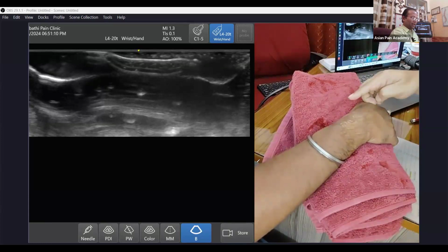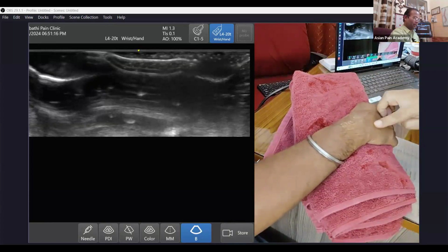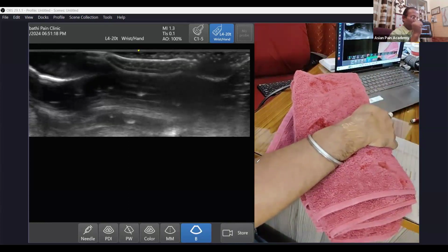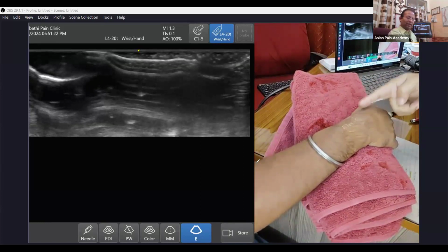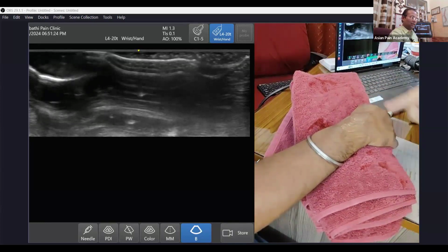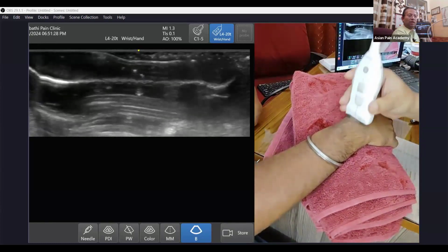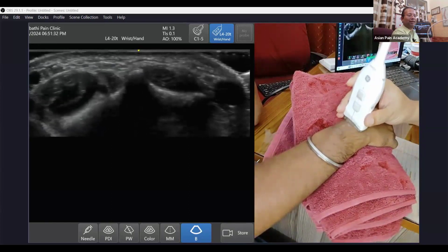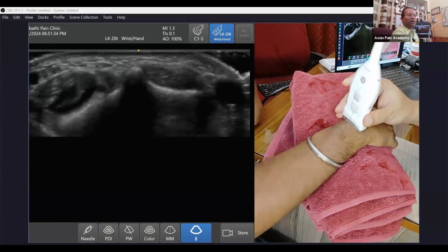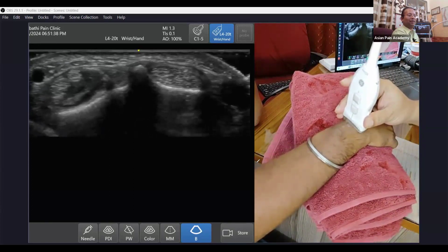So scaphoid, lunate, triquetrum, and pisiform. So the scapholunate joint, from this radial side to ulnar side. So how will we find it? Let us go again to the Lister's tubercle area. From Lister's tubercle area, let us go to the dorsal intersection area.